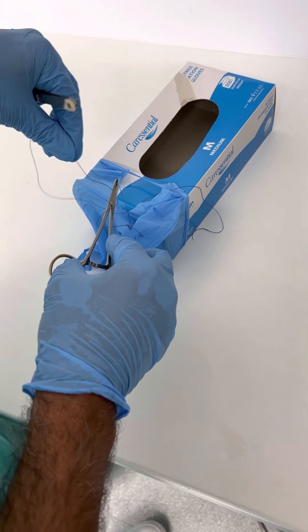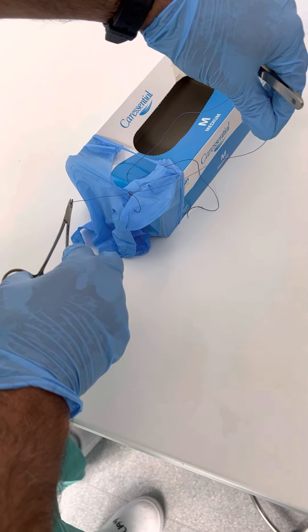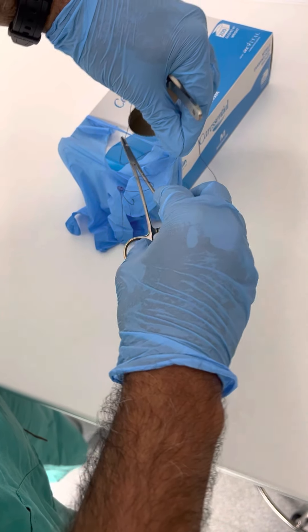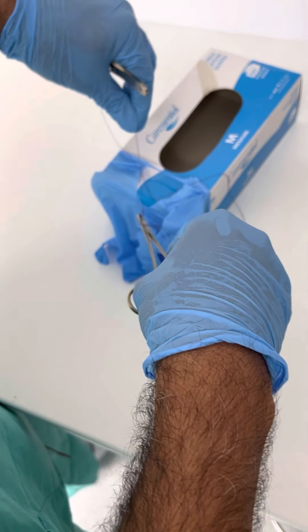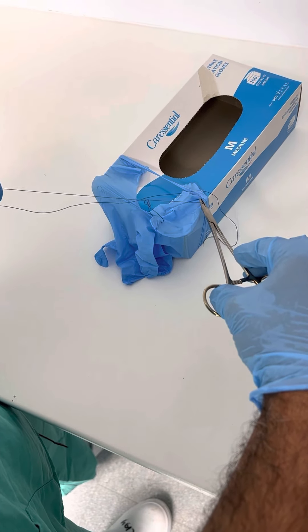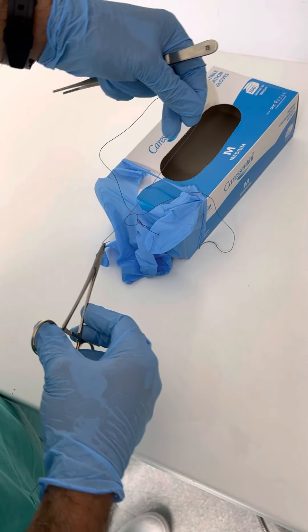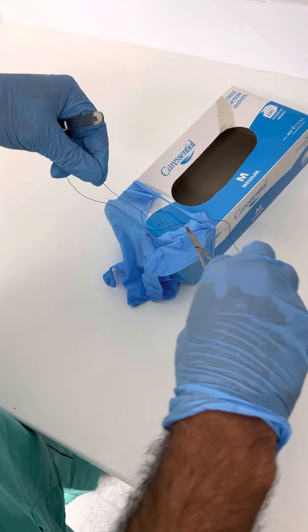The hand on the left side now goes to the right like that. And again there's a V again — this stays inside the V. It comes there like that. Notice my left hand stays on the right side, then moves in the opposite direction. That way I'm ensuring that I'm creating sutures which are square, and they are much less likely to slip.